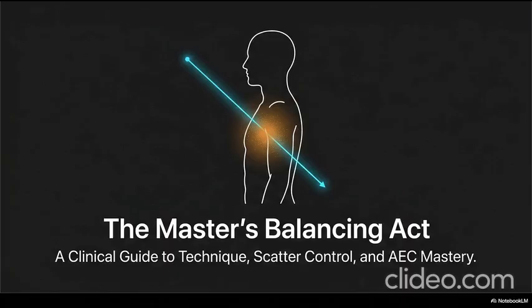Okay, so managing the mA, balancing the kVp, calculating the inverse square law for distance, fighting scatter, applying grid conversion factors, and ensuring microscopic mechanical alignment under a sick, moving patient. It's a lot. The cognitive load is immense. To help manage this, modern X-ray consoles employ a system to automate the exposure, right? Yes, automatic exposure control, or AEC. It is an incredibly powerful system designed to standardize image quality across patients of all different sizes, but leaning on it without a deep understanding of its mechanisms is highly dangerous.